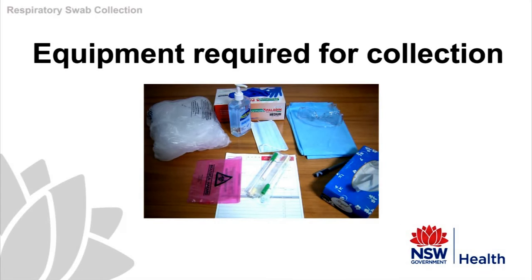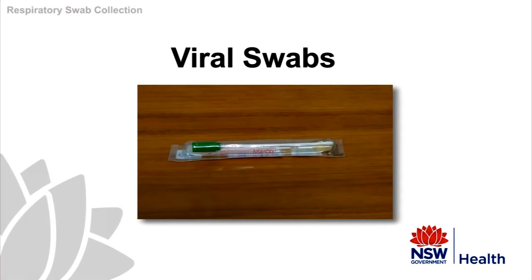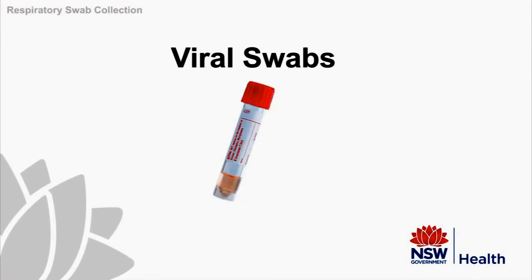Always check that you are using the correct type of swab — that is, a viral transport swab. Please note there are a variety of suitable swabs for taking viral specimens. We are demonstrating the use of two of the most common types: a green-capped viral transport tube, and a universal transport media UTM tube which uses a flocked swab.